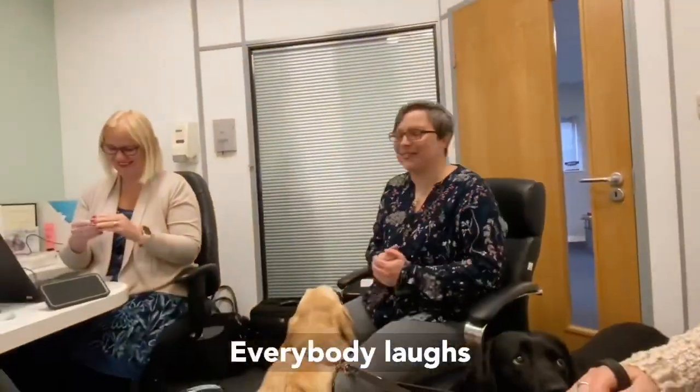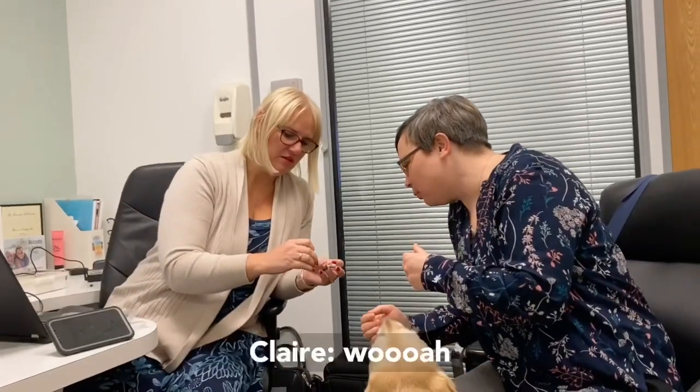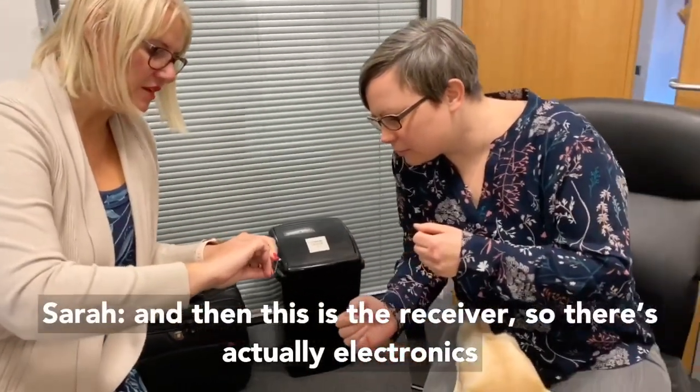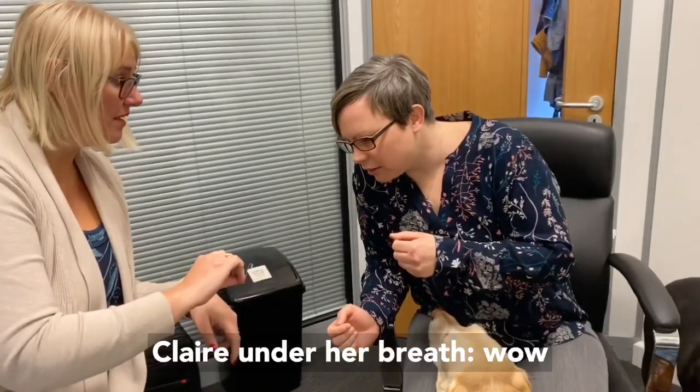Just a bit. Yeah. You see, these are a lot thinner, so they won't be as noticeable, but they've got a very thin wire going through here. And then this is the receiver. So there's actually electronics in there that put the sound directly into your ear.